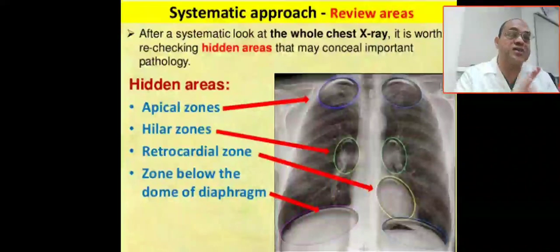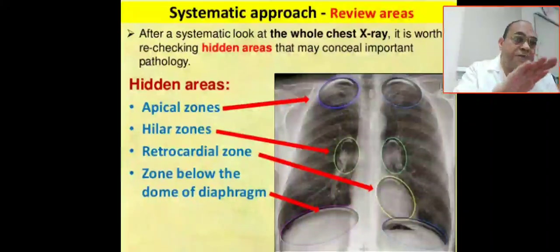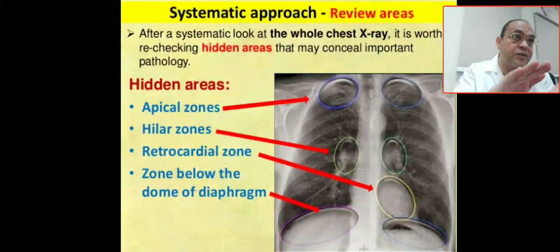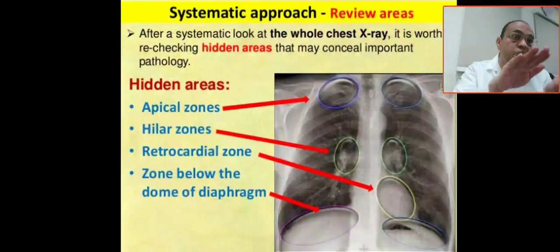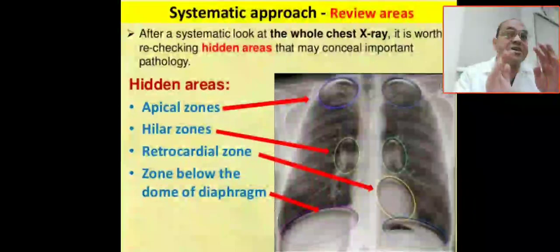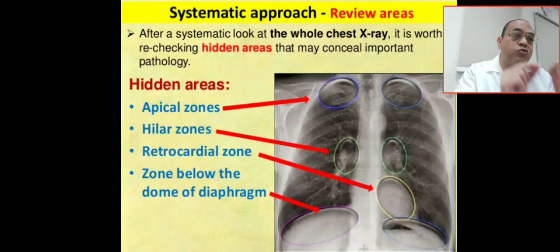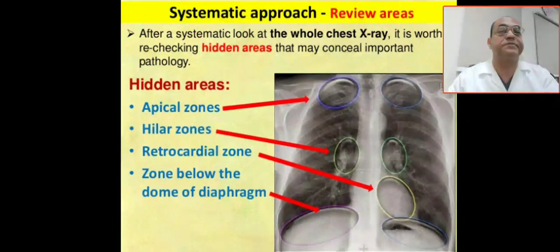The third hidden area is the retrocardiac zone. The cardiac shadow can hide areas of the lung that may have a lot of pathology. The fourth area is the zone below the dome of the diaphragm, which can be obscured by the liver and spleen.